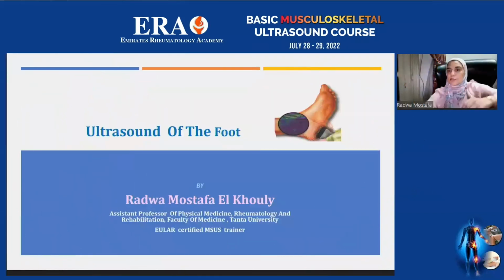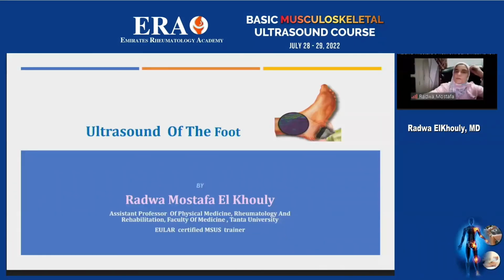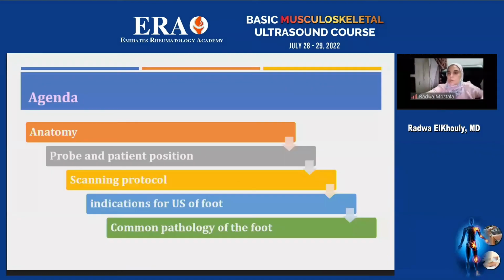Thanks, Professor Ahmed Al-Gamal, and the Emirates Rheumatology Academy, and all for the invitation. I will start ultrasound of the foot. I will start, okay.